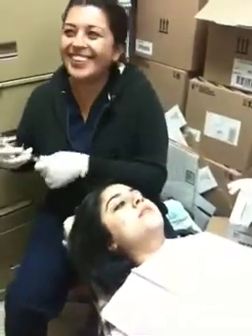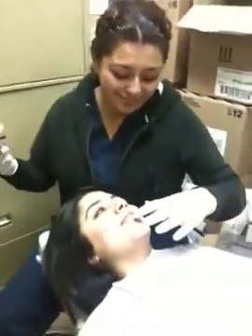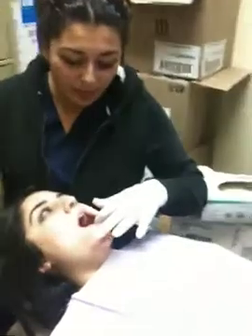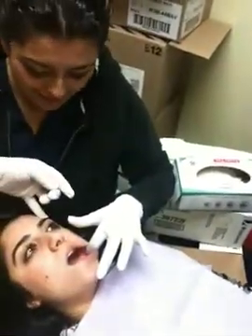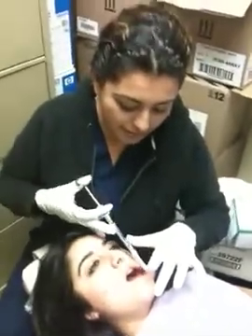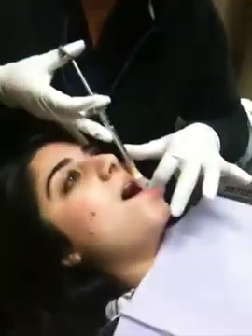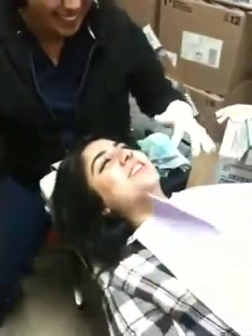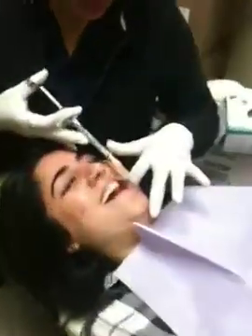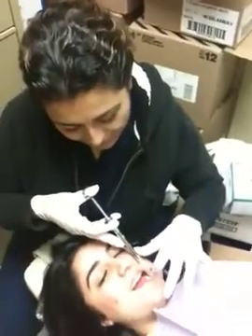Can I grab it like this? Sure. Remember, Ariana, you had to follow the axis of the tooth. Where are you going? Long axis? You're going to fold them up here, remember? Just tell them to close their eyes. See how stable that makes you? That's good. Can you close your eyes, please? It's a pretty big needle and I don't want to scare you. So you'll be doing extra-oral fulcrum. Very good. You feel stable, right? Yes, I do.